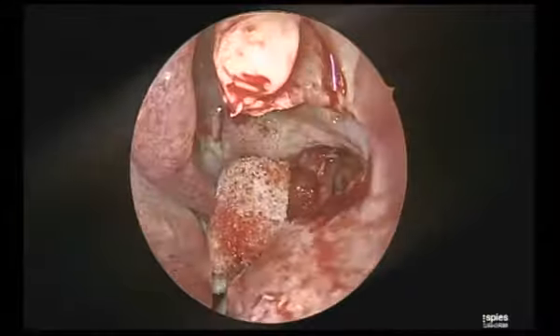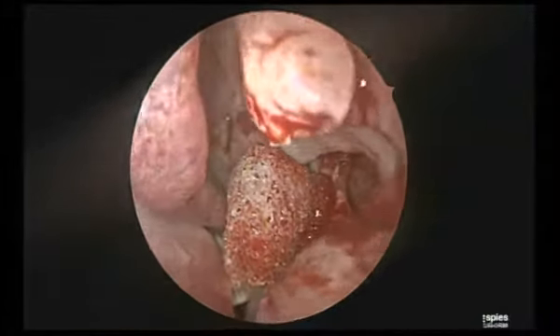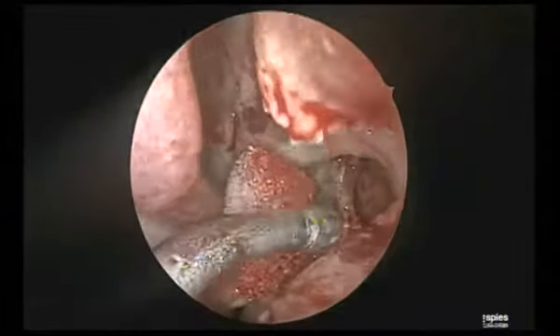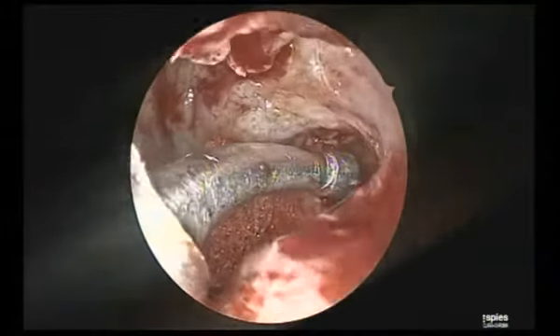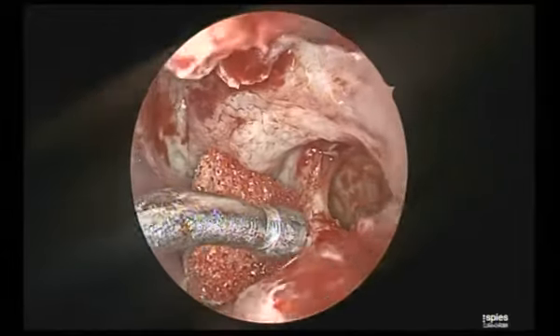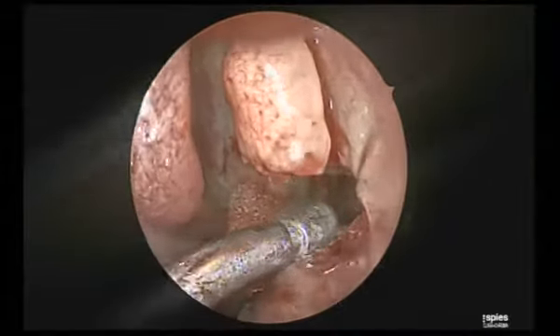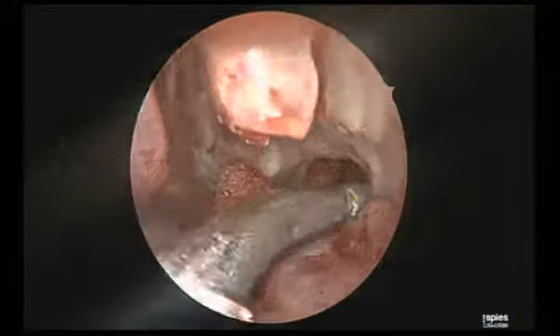See, there are 4 types of middle meatal antrostomies. This is what I have done as the simplest one. Now there are other 3 varieties of middle meatal antrostomies. If I flush this medial wall, remove this completely and flush with the posterior wall behind, that is a little bigger, type 2 middle meatal antrostomy. If there is too much of disease, I need a mega antrostomy for future surveillance and irrigation, like massive fungus and massive diseases, which is not there in this case.